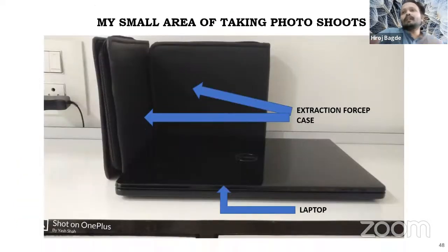Then there is intraoral photography, and some areas are extraoral photography. We can utilize black backgrounds. We now have photo studios. We have small photo studios which are covered on all sides with lights, and we can place inside any black background, any white background, any colored background, whichever you want.